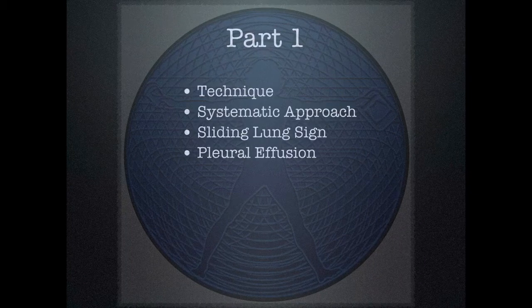The first part of this lecture is going to focus on the technique for thoracic ultrasound, a systematic approach for thoracic ultrasound, the sliding lung sign, and detection of pleural effusions.